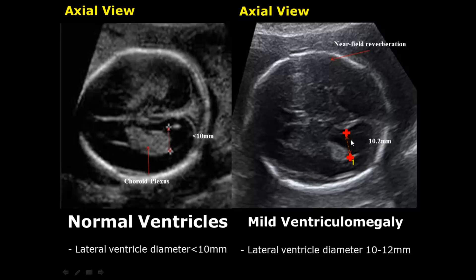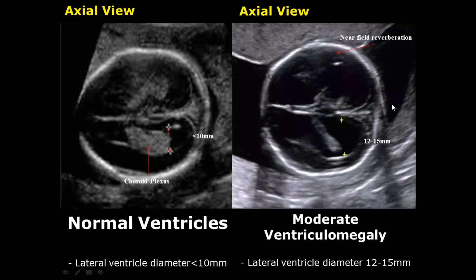Over here the lateral ventricle diameter is more than 10 millimeters. If the diameter is between 10 to 12 millimeters, it is termed mild ventriculomegaly. We do not see the near side clearly because of the near-field reverberation artifact, which occurs due to the skull bone — the ultrasound beam has higher energy in that area, causing large reflections. In moderate ventriculomegaly, the size of the lateral ventricles is between 12 to 15 millimeters.